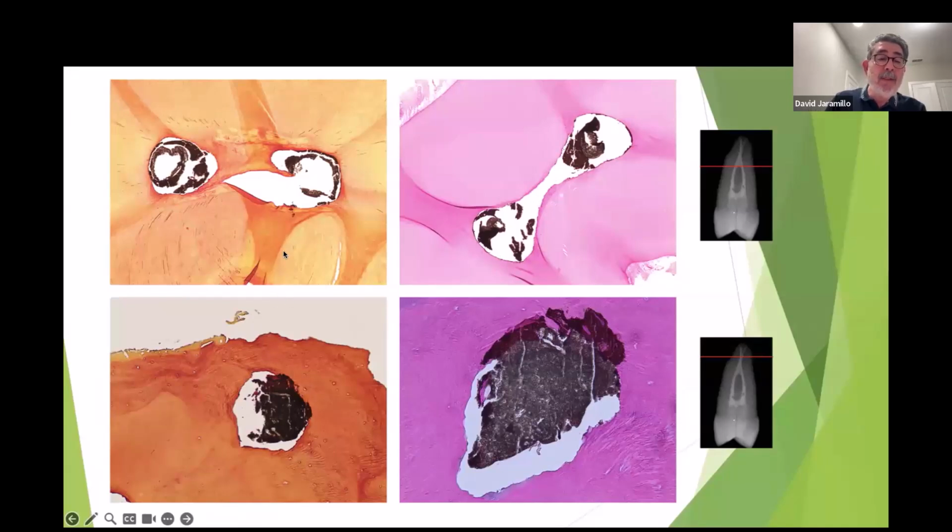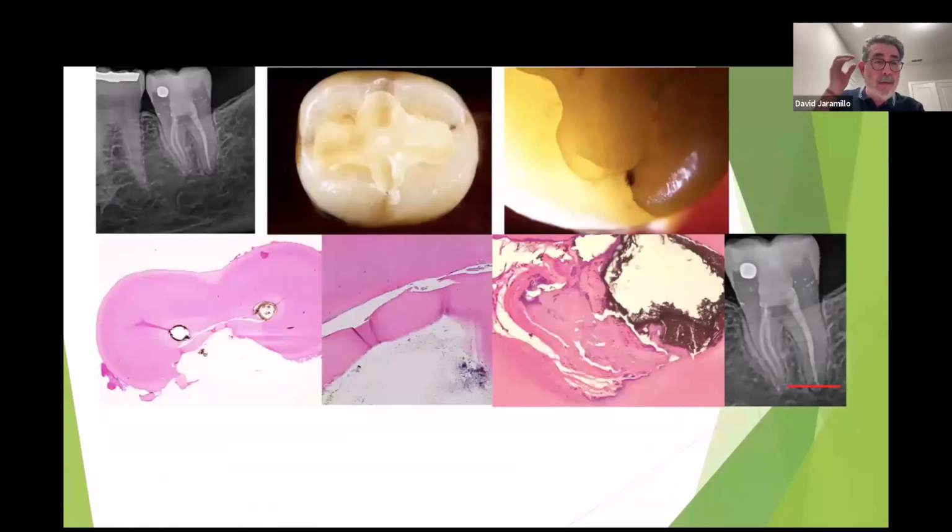The orange sections are Gram staining for bacterial detection. This is H&E for pulp tissue detection. Basically just the sealer. The sealer moved from its original position inside the root canal. So the root canal is very clean, but the reason for the failure was the crack.